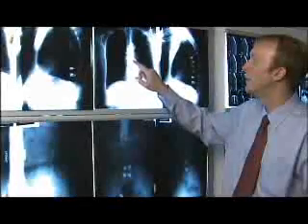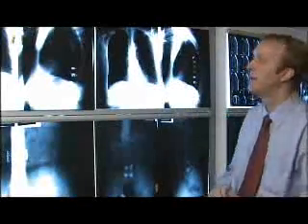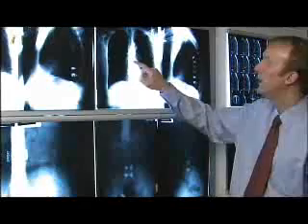Now, most compression fractures are caused by osteoporosis. Some are also caused by metastatic disease, such as some lytic type processes that may destroy the bone. It's often common in individuals with osteoporosis that multiple levels of the vertebrae will be weakened due to the osteoporotic nature of the bone. These radiographs will show where the bone filler has been inserted into the compression fracture in each of these three levels, and a reduction of the normal configuration of the vertebral height has been achieved.